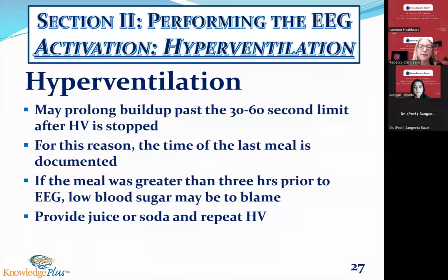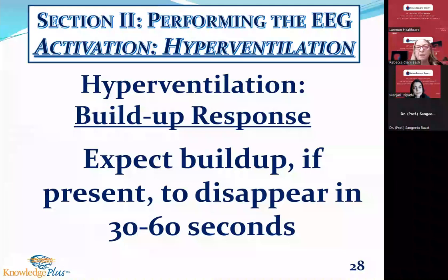Now it's important when you come upon prolonged buildup to give your neurologist, or whoever's reading the study, a heads up. Say, 30 minutes into the recording, they had prolonged buildup. It's easy to miss something like that, especially if your neuro is reading a dozen EEGs a day. So again, that buildup response should disappear after a minute.